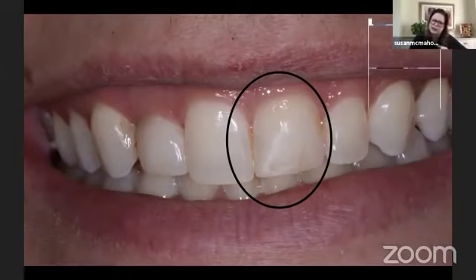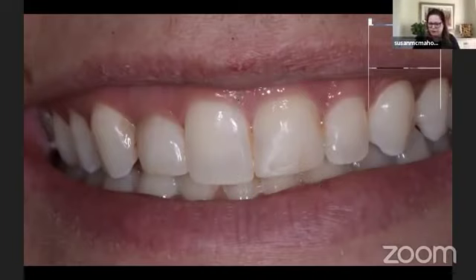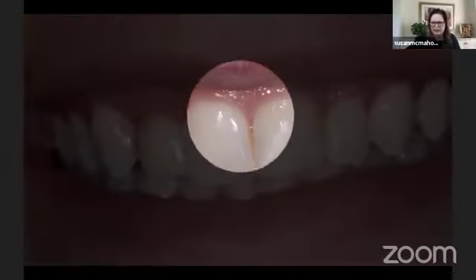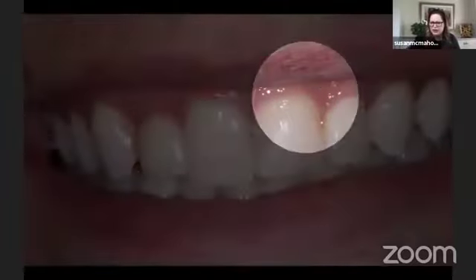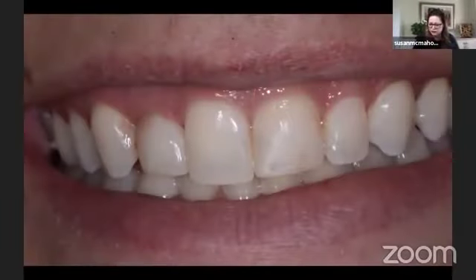So she had a class 4 fracture. Somebody put some composite on it. She wasn't happy with the way it looks. And I just want to take a quick look at why it doesn't look the way we want it to. When we look at the line angles here, she basically has a flat plane of composite. The color is not bad, right? It doesn't look too bad. It's not translucent. You can't see the line, but the outside form, the anatomy, is not quite right.